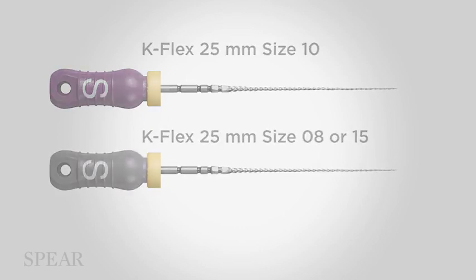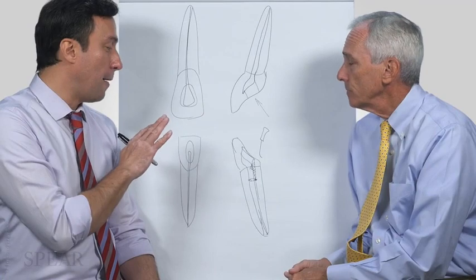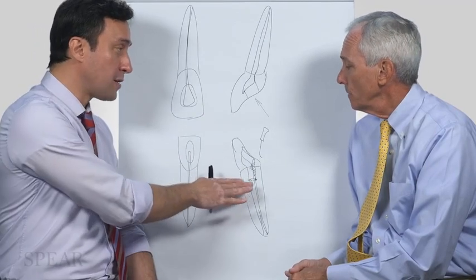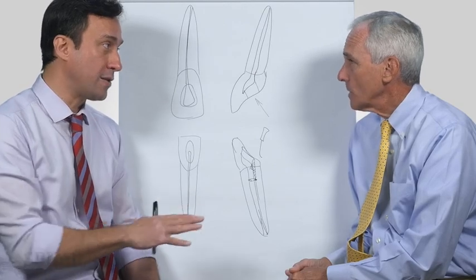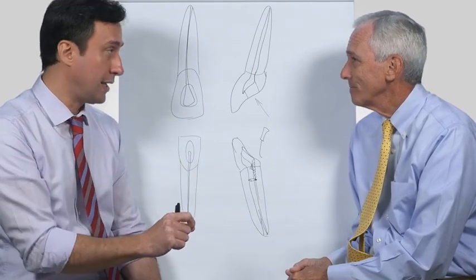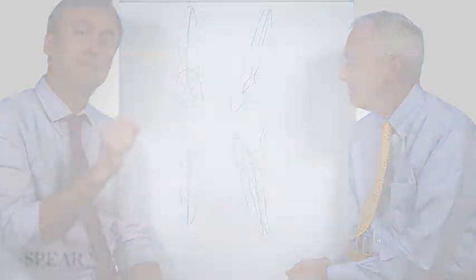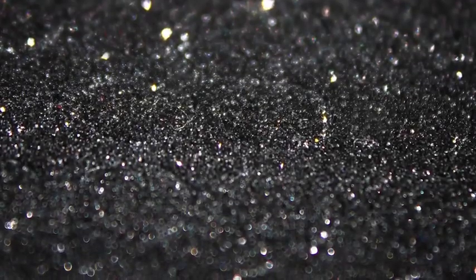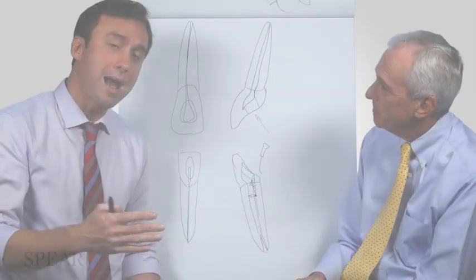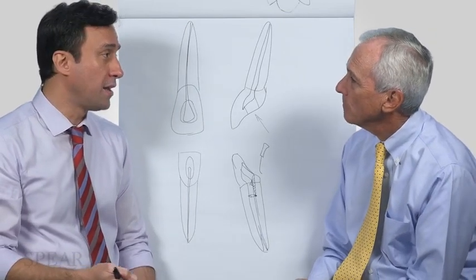What burr do you use, though? Oh, so I would try, if it ends up going pretty deep, then I would try to stay away from burrs, because that would be too aggressive. You can't see it. There's a high chance. Ultrasonic would be the key. And I think in that situation, the E14D tip would be the right tip to use. The diamond coating allows you to nicely just remove that. Now, these tips, by the way, have to be replaced often. They hardly ever break, though.